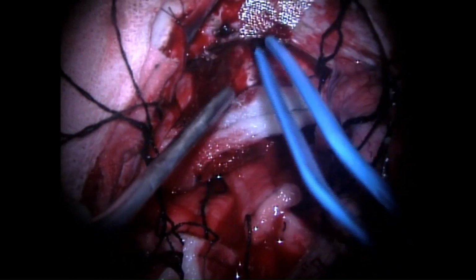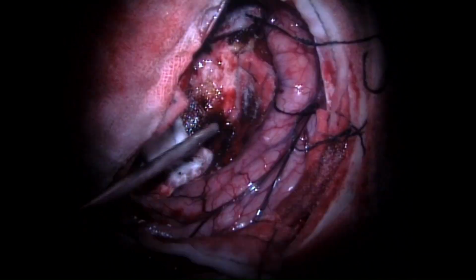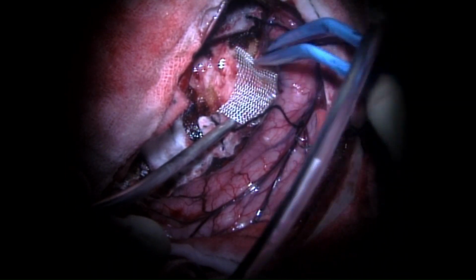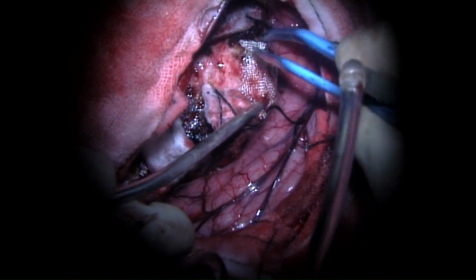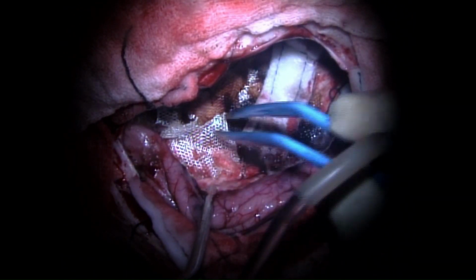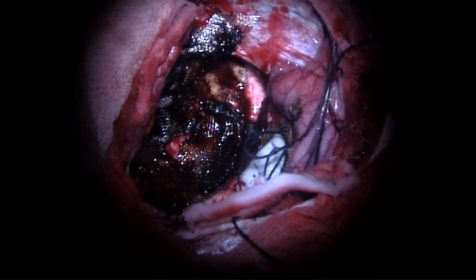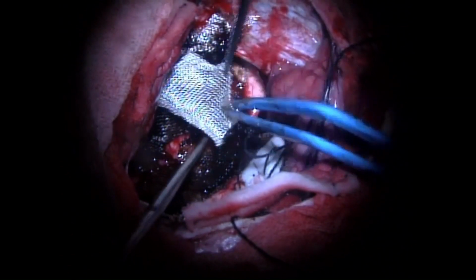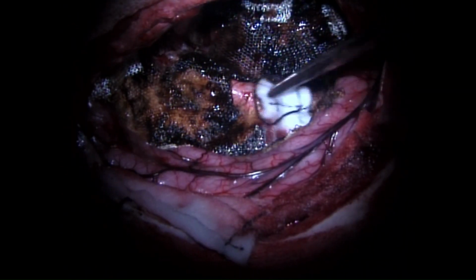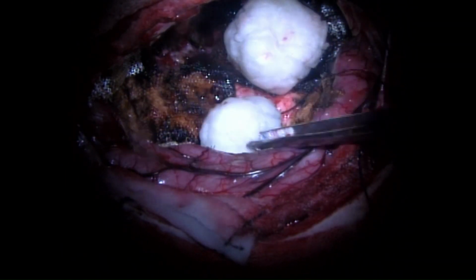You can easily see the floor of the middle cranial fossa seen on the contralateral side. Hemostasis starts with the use of small pieces of surgical material to cover the nude brain, and this was followed by the placement of cotton balls to achieve satisfactory hemostasis.